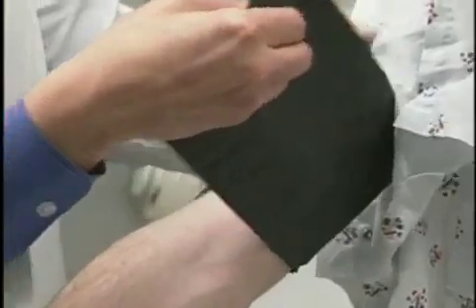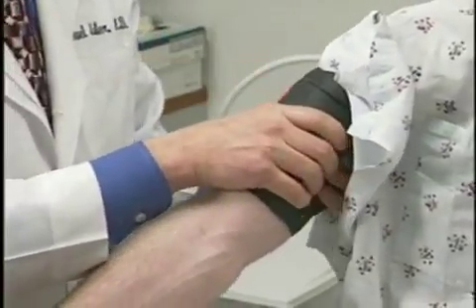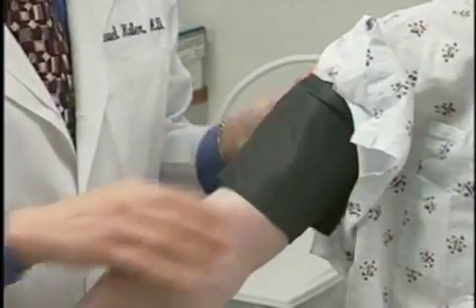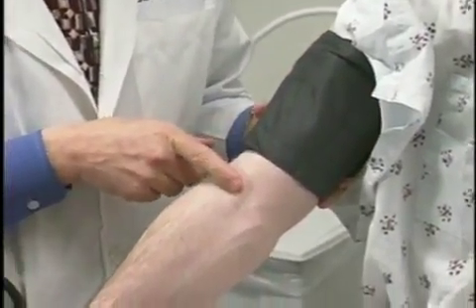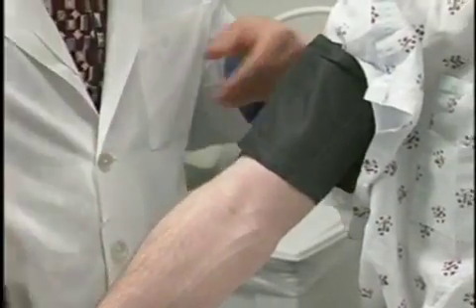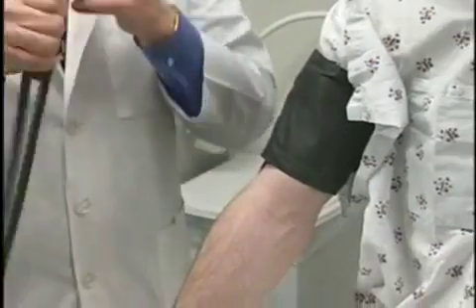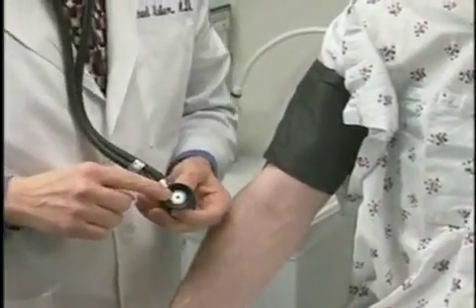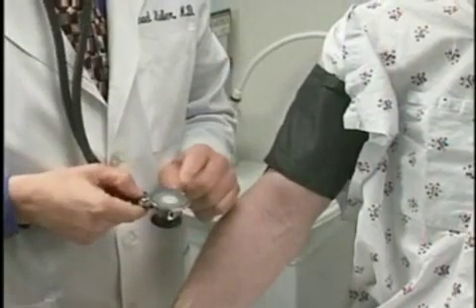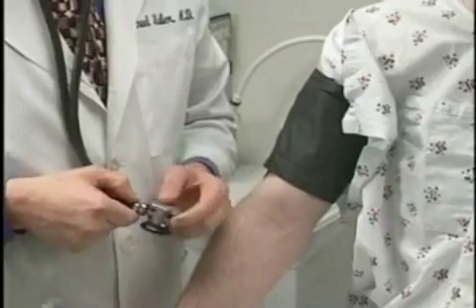So a normal adult cuff fits Dad just fine. We'll go ahead and place the blood pressure cuff snugly on his arm. You'll notice I'm approximately 2.5 centimeters above the antecubital fossa. Bates will recommend that you check the blood pressure with the bell of your stethoscope, but I think you'll find most physicians at Loyola use a diaphragm to measure blood pressure.